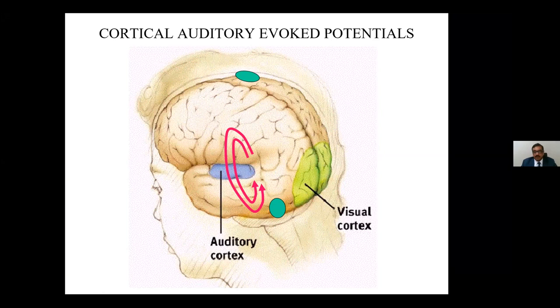It is adult-like. So in this 1 year, as the child is hearing more and more, auditory experience in the cortex makes the curve mature. So by looking at the evolution of the curve, you know that not only is this person hearing, but is actually developing an auditory experience and an auditory memory. And these are people who are developing a normal auditory function. So it's a biomarker for auditory cortical maturation. The auditory cortex is getting mature.